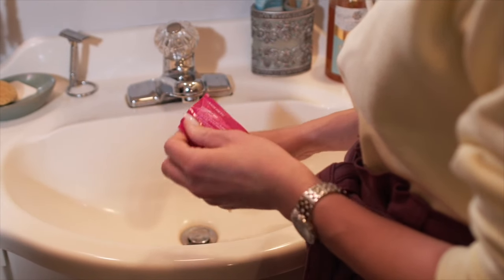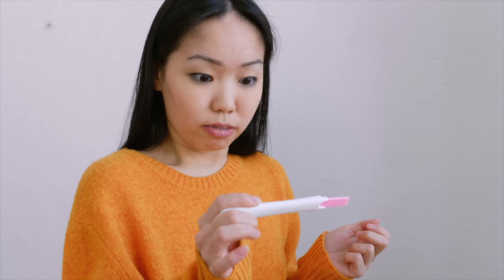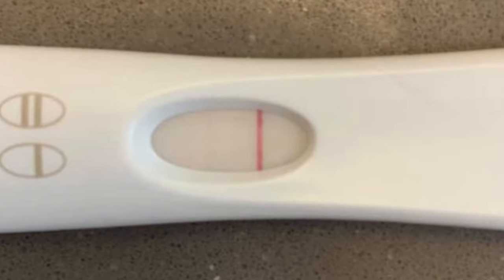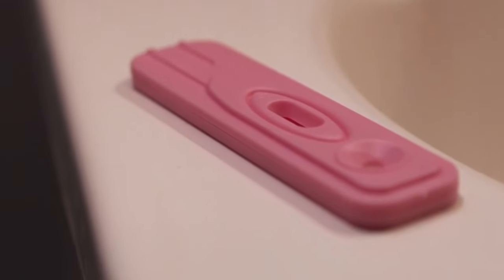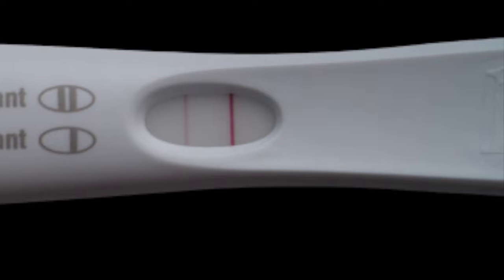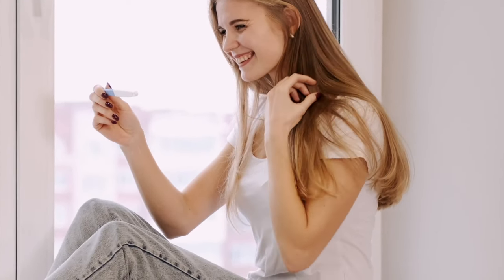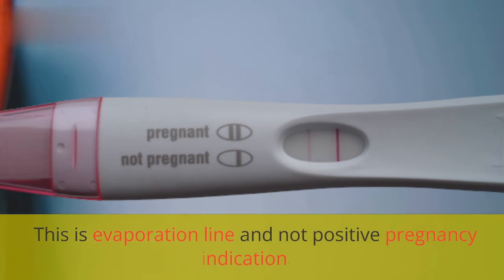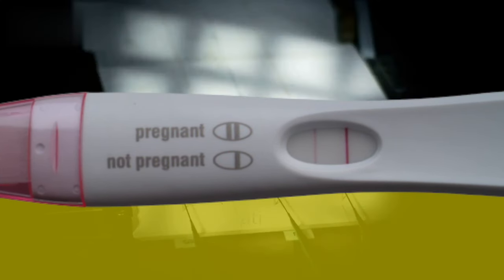This was about the positive pregnancy test, but in case you have waited for the time duration that is mentioned in the instructions after dropping the urine and no test line appeared, you would understand that you are not pregnant. But there could be a case when you let this test lie for some time, and sometime after when you come back, you see that there is a faint line at the test line, and this will give you an impression as well as confusion whether you are pregnant or not. This faint line that appeared long after the reaction time in the pregnancy test kit is known as an evaporation line, and this shows that you are not pregnant.